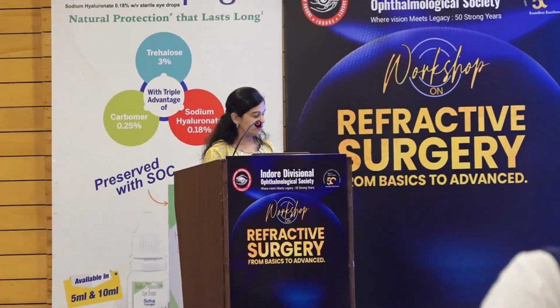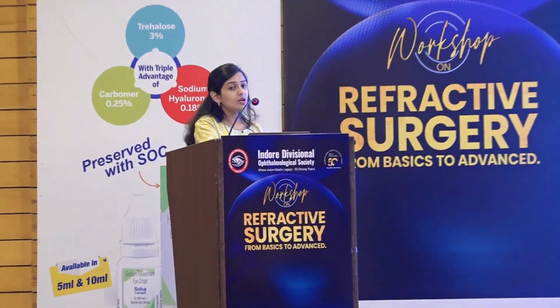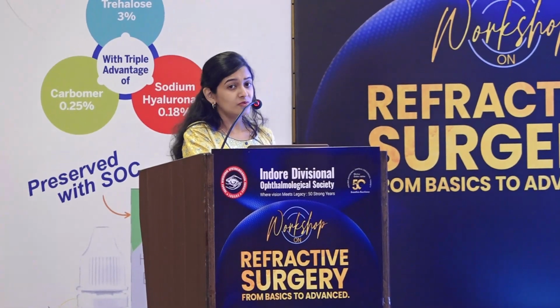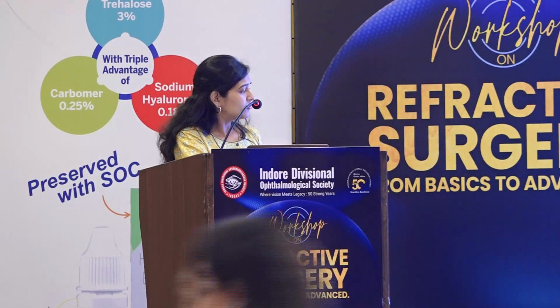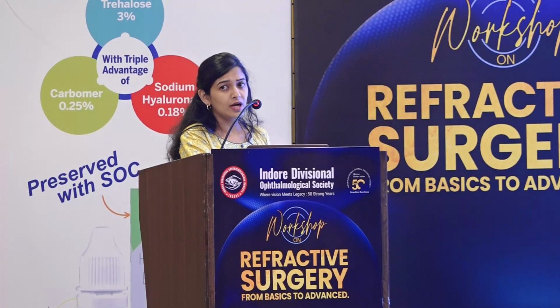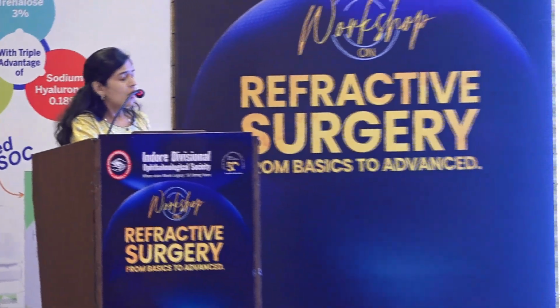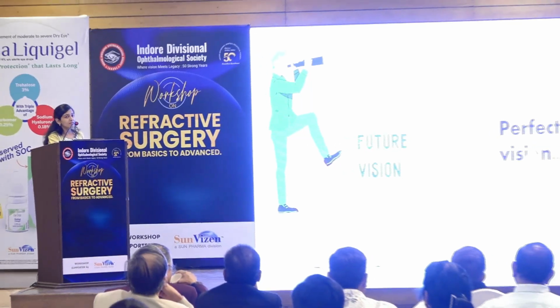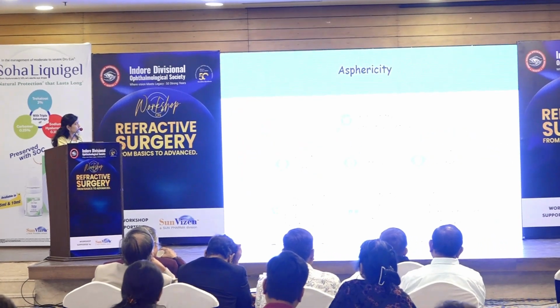Contoura LASIK and overview. So we all are aware of the different ablation profiles based on which different types of LASIK have evolved over a period of time, starting from standard LASIK to wavefront guided, wavefront optimized, topo guided, and now with the newer development in ray tracing technology in the form of Wavelight Plus. All with a single aim to provide patients a vision as close to perfect as possible.